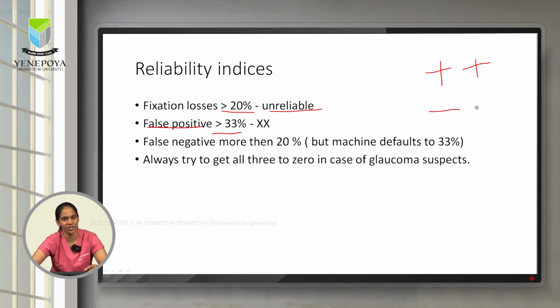Actually, if you have undergone a perimetry yourself at some point, you will involuntarily find yourself being a high false positive patient, because when the stimuli are presented, there is an accompanying sound in the perimetry that you can hear. After some time, you will automatically start pressing the remote when you hear the sound, even when you don't see the light. This also causes the false positive. We call that a trigger happy patient. Even though a patient has glaucoma test changes, it will look like it is completely normal, and that is something that you don't want happening, right?